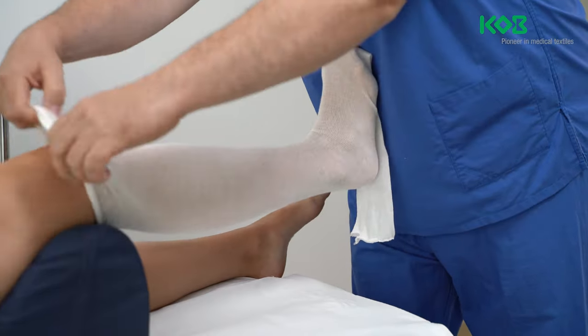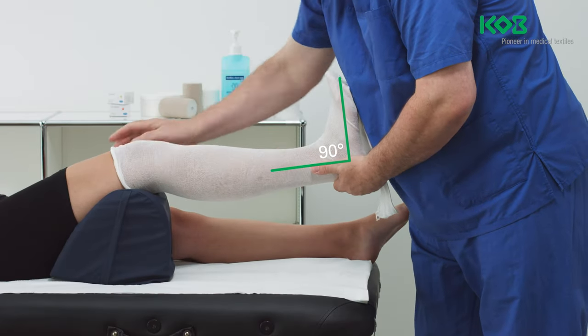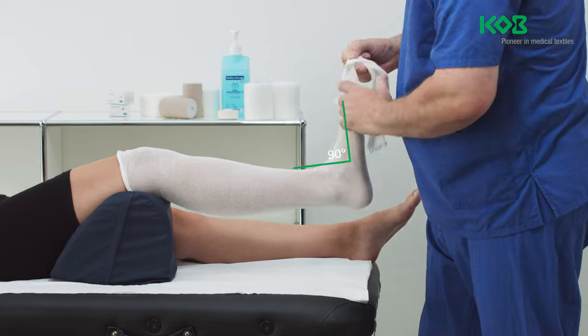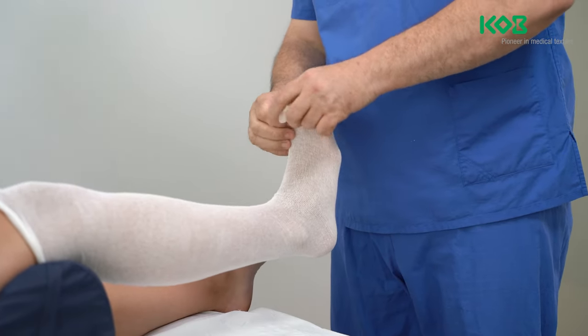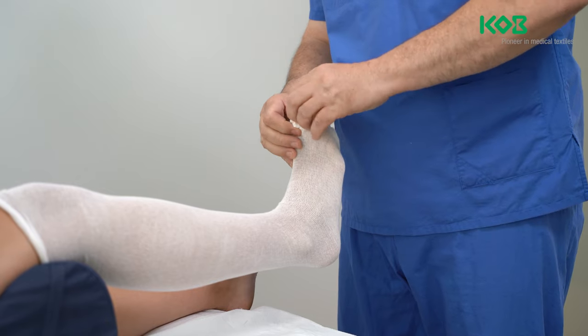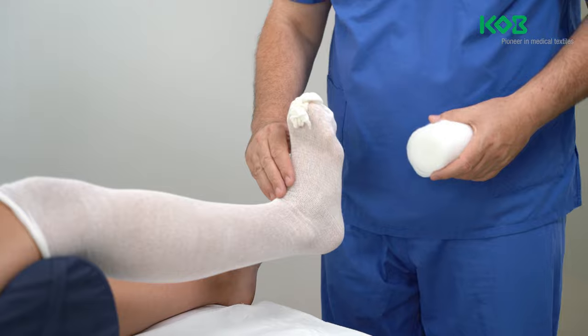When applying the bandage, ensure that the patient's foot is placed at an angle of 90 degrees to the lower leg and that this angle is maintained throughout the entire application. Protect the skin of the lower leg by applying a tubular bandage that projects about 20 cm beyond the toes and above the patella.